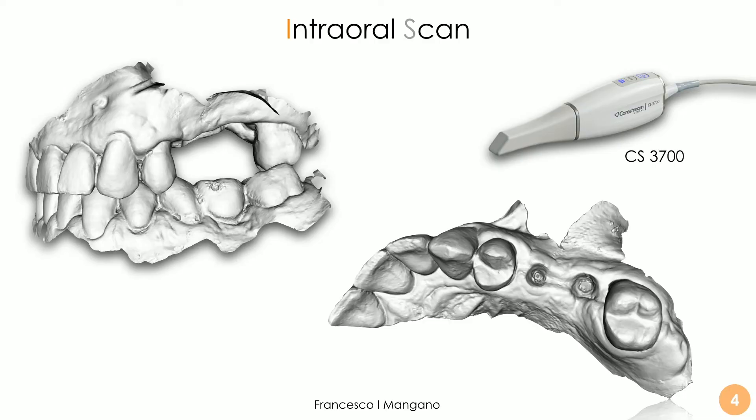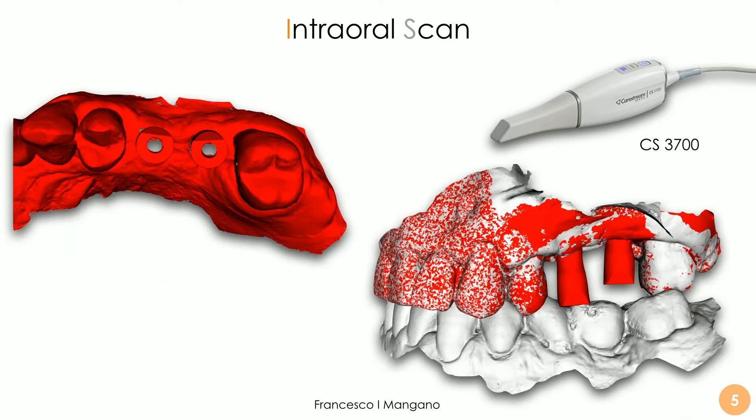We had a patient with two implants in the posterior maxilla on the left side — one second premolar and one first molar. The implants placed were two BT-Safe implants from BTK Biotech, Povolaro di Dueville, Italy. We captured the intraoral scan of the position of these implants using our CS3700. First we remove the healing abutment and capture the mucosal collar and the master model, then capture the antagonist arch and the bite, and after this we screw in our scan bodies — in this case from the BTK company. The scan bodies are captured in full to transfer the position of the implants to the dental technician.